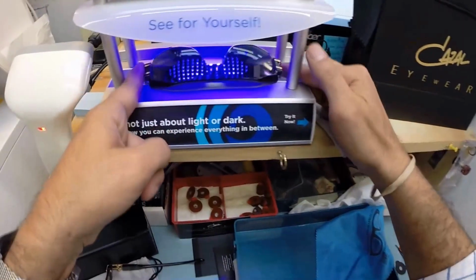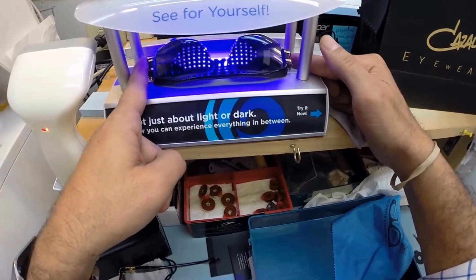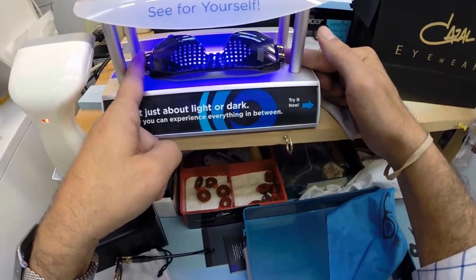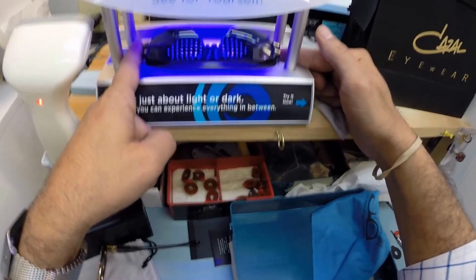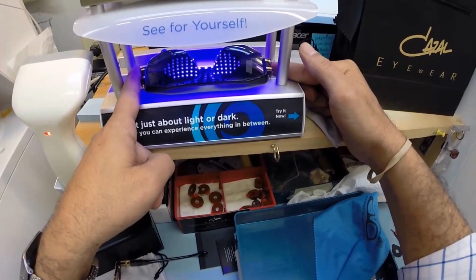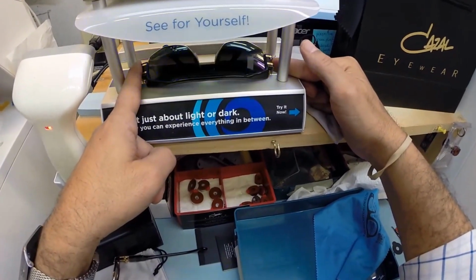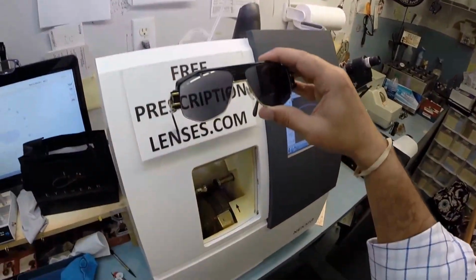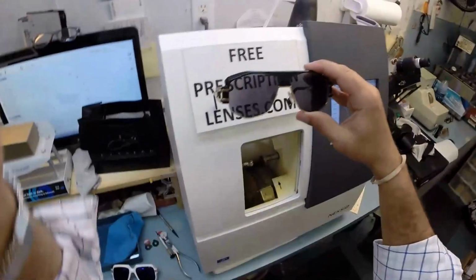Now, transition lenses will work as long as you're in direct exposure to the sun. The one time they won't work is if you're behind the windshield of a car. Unless you have a convertible, like my wife's car, or a motorcycle, they will not darken. Now, as soon as you step out of the car, they will. Your windshield has UV protection to stop your upholstery from rotting or your dashboard from cracking while your car sits in the sun, and that's why they won't turn dark in a car.